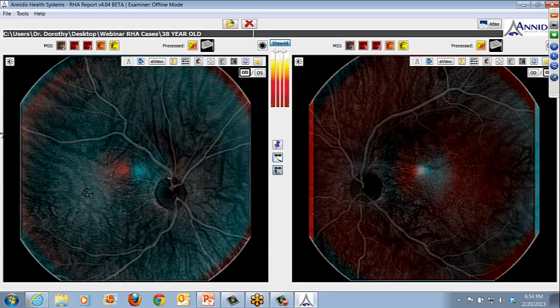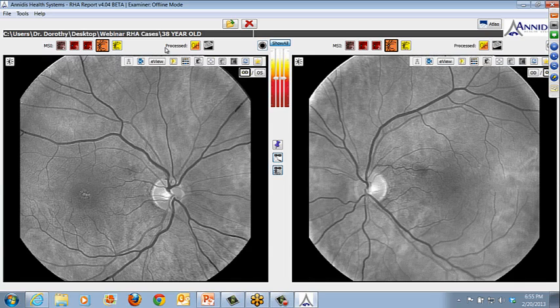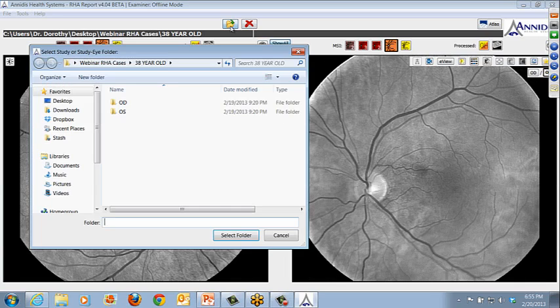and his stereo map, and I'm sure you're all sitting there with your glasses ready to go, but you can actually see that there's some sense of depth here, but really it's because the upper layers of the retina are clear, but there is no actual elevation. Okay. And the patient's pupils are quite small, so these are pretty good images for a screening. I was actually quite pleased to see that for this particular patient. He quit smoking. I'm happy about that.